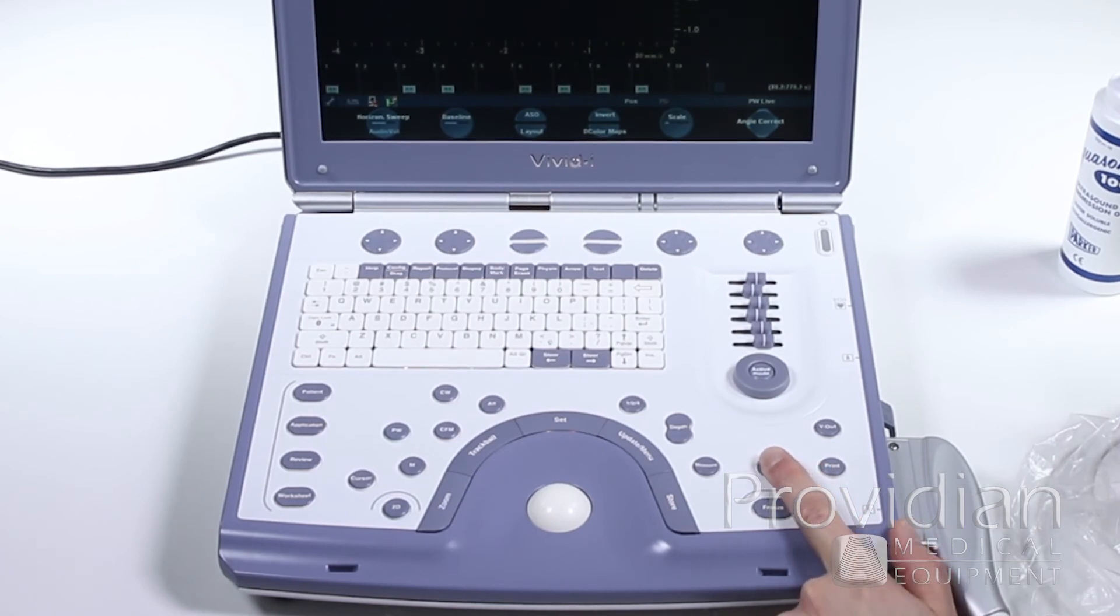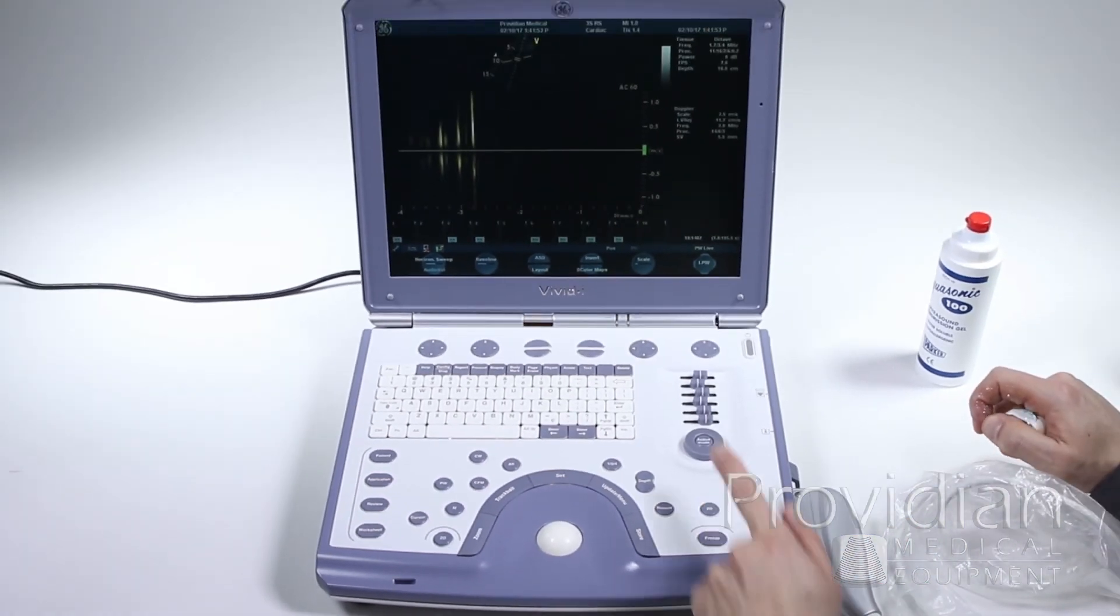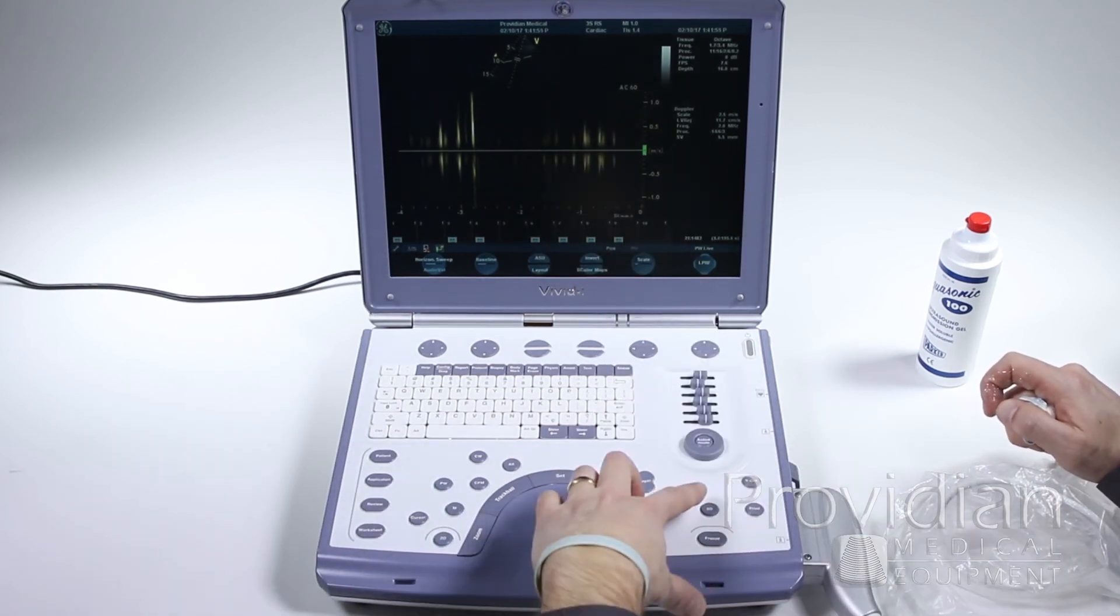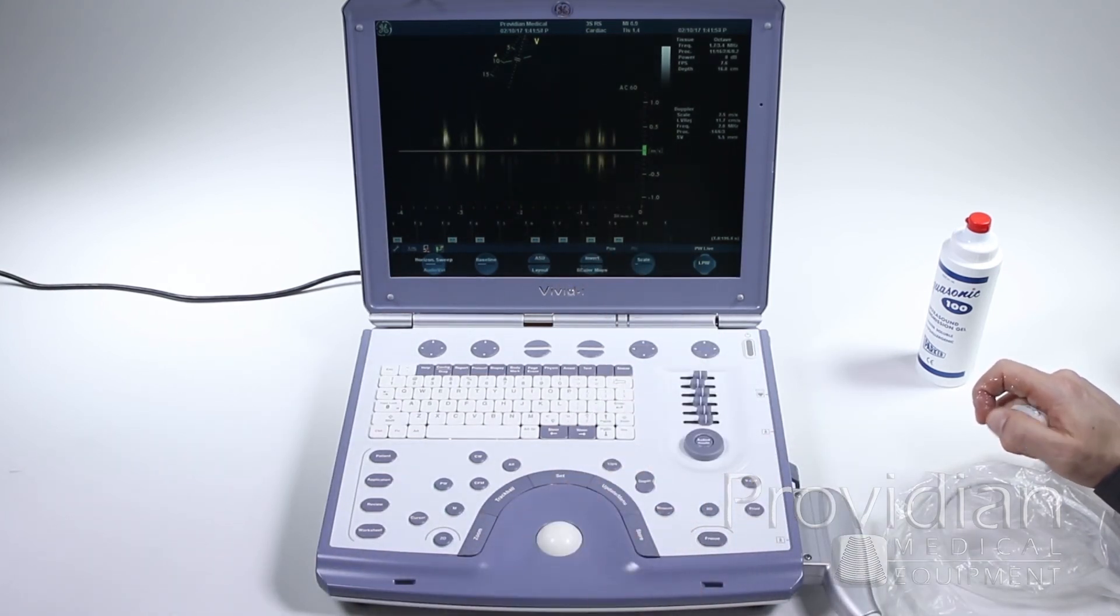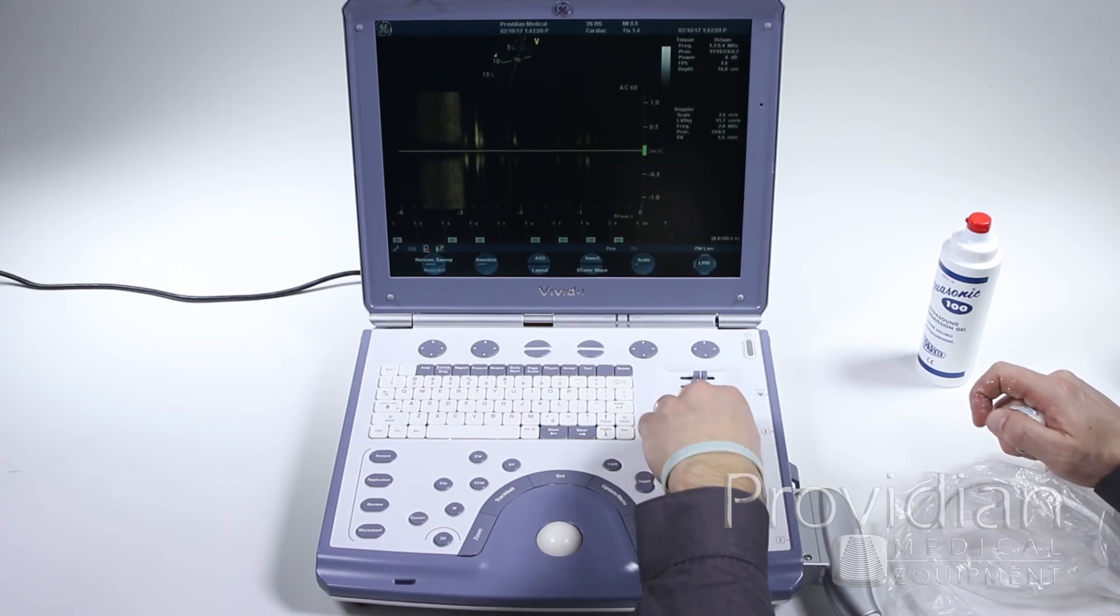It's kind of a mysterious little thing, but if you hit 2D, it will give you a live update up top. It's actually a 2D freeze and unfreeze for when you're in these kinds of imaging modes.